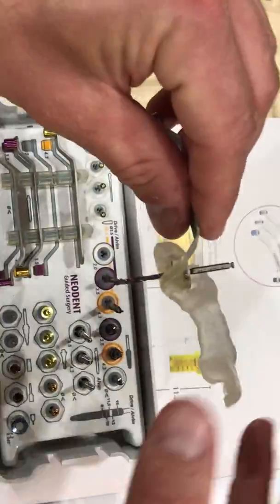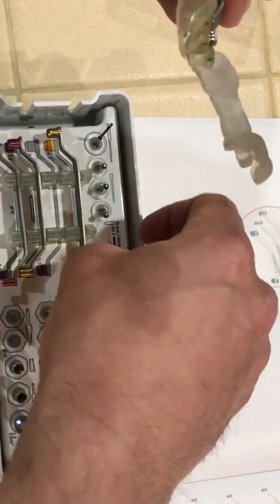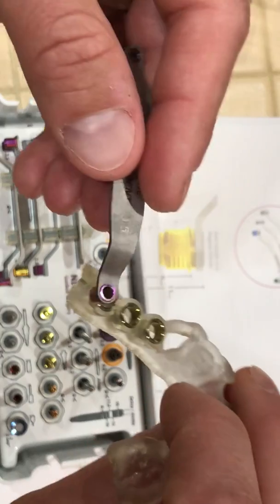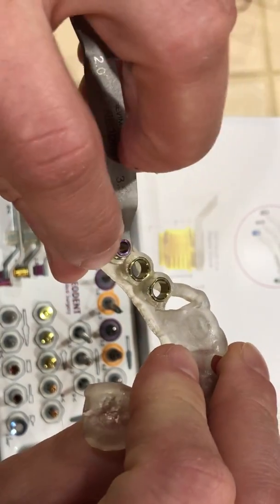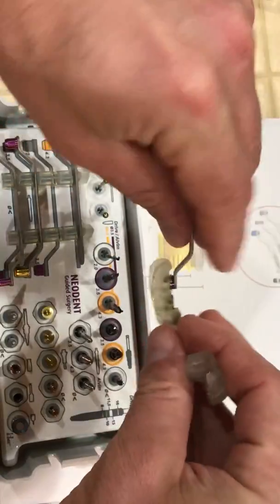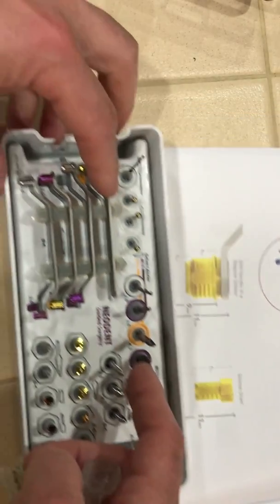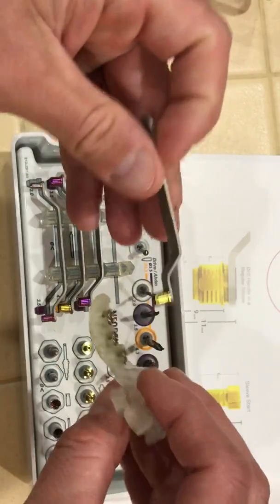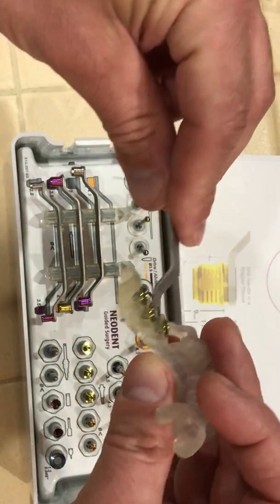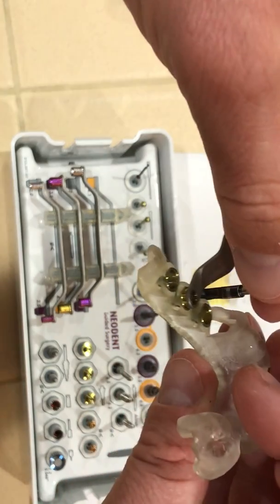After we're done our drilling sequence — going from the 2 up to the next size — we take the spoon out and actually flip the spoon. This is for the regular sleeve, and now it's color-coded to match the 3-5 drill. When we're finished, we go to the spoon above because this one matches in yellow the 4-3 drill and it drops into the spoon, again adding 2 millimeters. We take our drill from here — this fits perfectly. There are no stops on these.